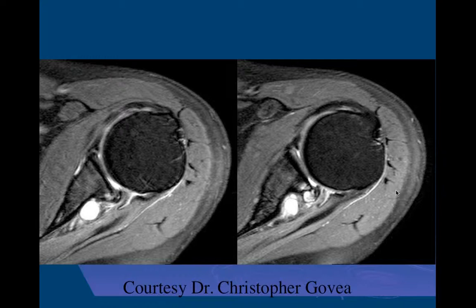Let's see, Michael, where is this cyst and what's it caused by? Okay, so we have a cyst. We have a posterior labral tear and also an associated paralabral cyst. On this image, I think this is the subscapularis. So this will be posterior to the glenoid, so this is going to be the spinoglenoid.